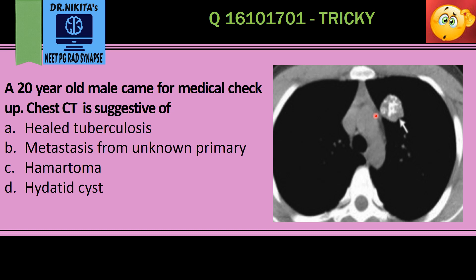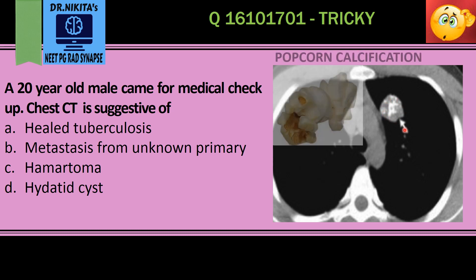Therefore it's a non-contrast CT of the chest. Here we have a lesion in the left lung which has a white appearance on a non-contrast CT. White on a non-contrast CT means calcification. The calcification in this lesion is very much like a popcorn, so it's a popcorn calcification in a lung lesion.